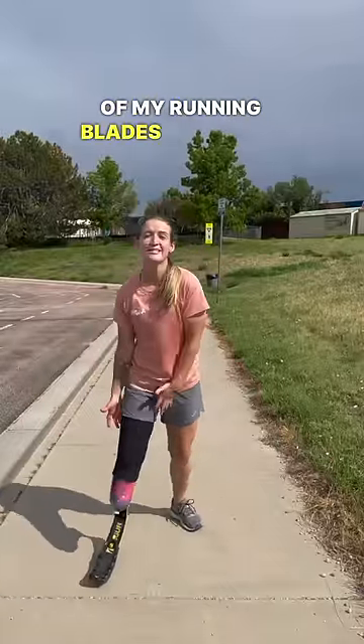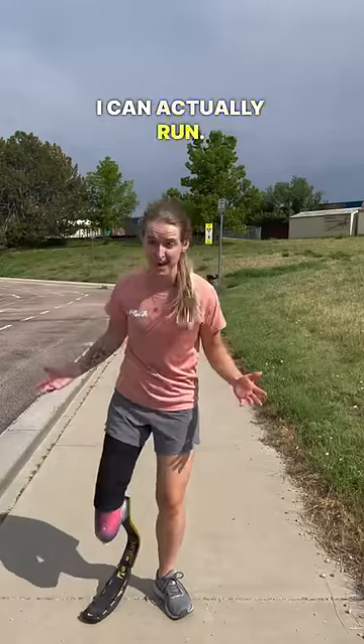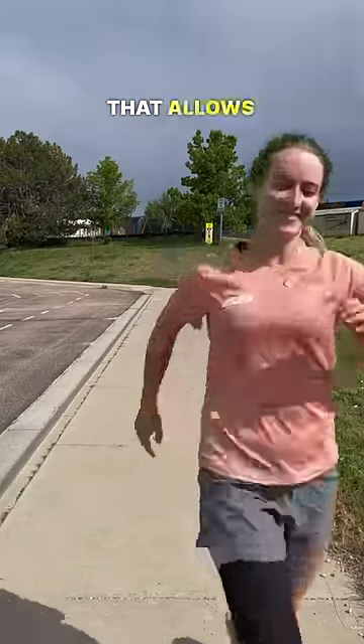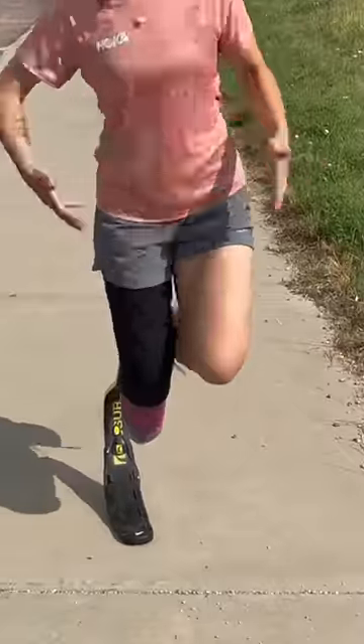This is one of my running blades, or sports blades. It's actually built to have the energy return to allow me to have that spring in my step where I can actually run. Running blades have that spring and that bounce, which allows you to be able to run more comfortably. See how I can actually get some bounce because it's got that spring.